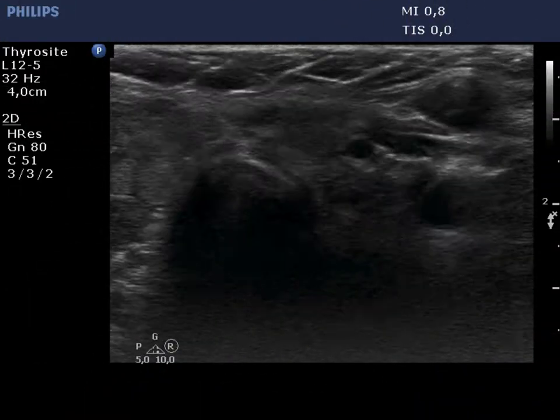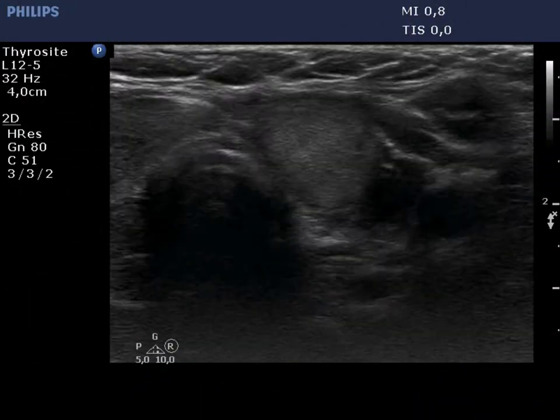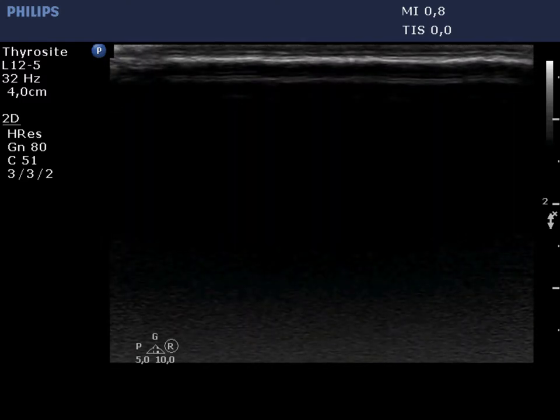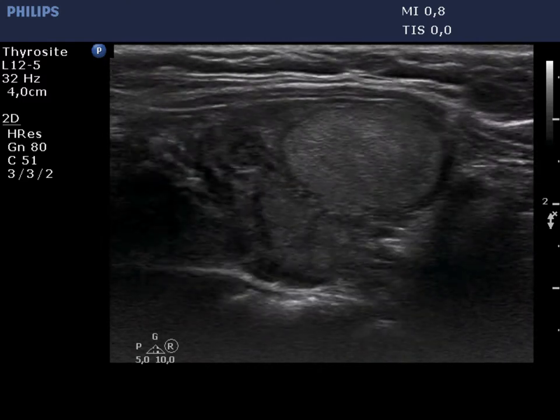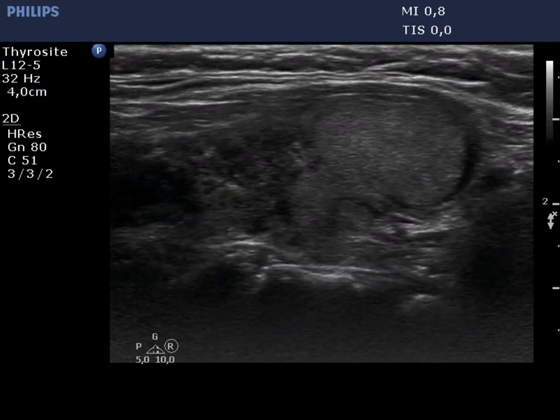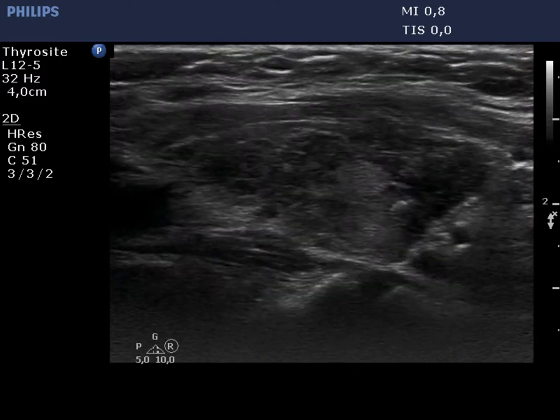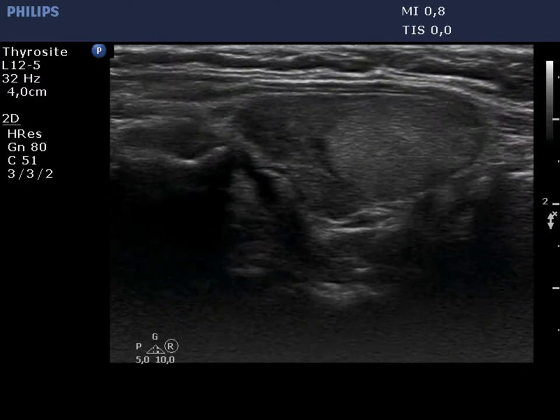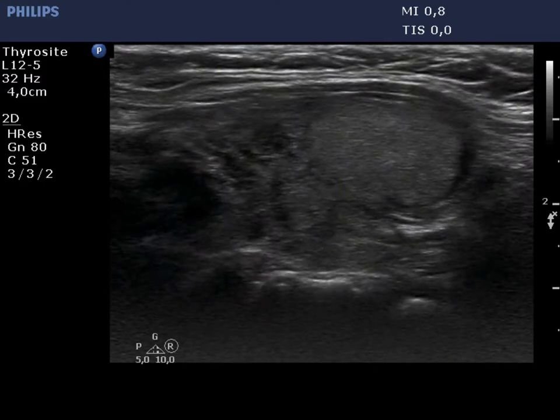The presentation of the left lobe is similar; however, there is a larger isoechoic lesion in the lower ventral part. It is doubtful whether this isoechoic lesion is a true nodule or not.